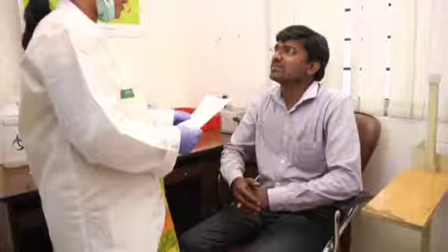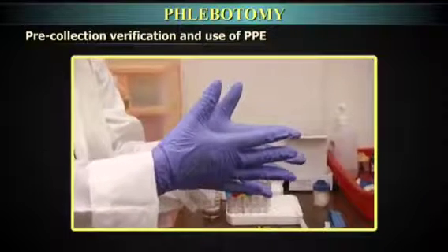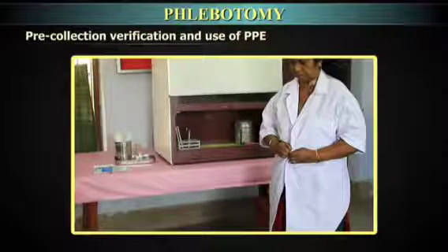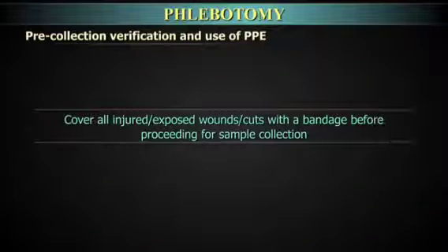Confirm the identity of the patient with the laboratory requisition form. Wearing gloves is mandatory before sample collection. Wear lab coat and mask. Cover all injured or exposed wounds or cuts with a bandage before proceeding for sample collection.